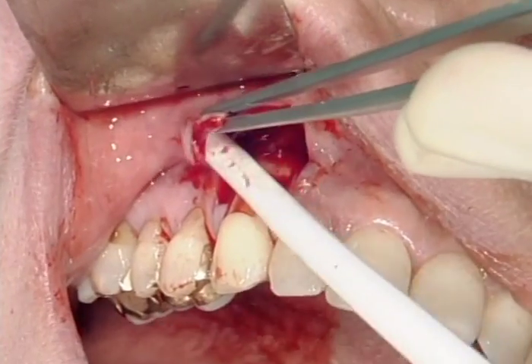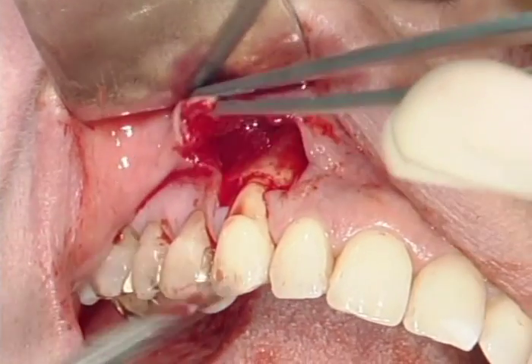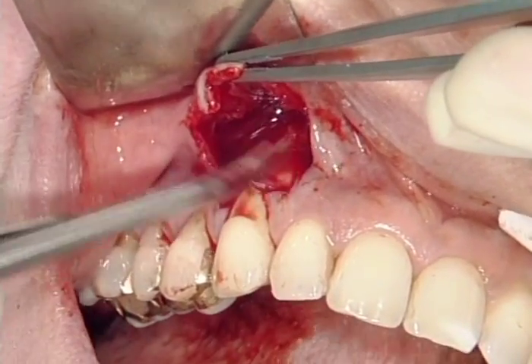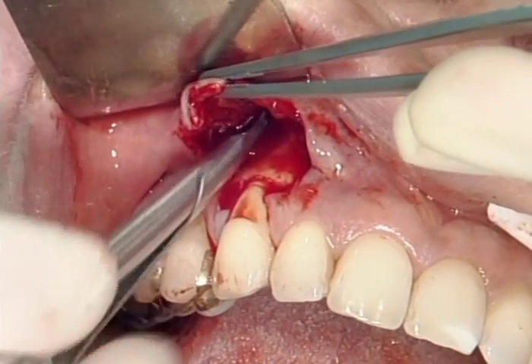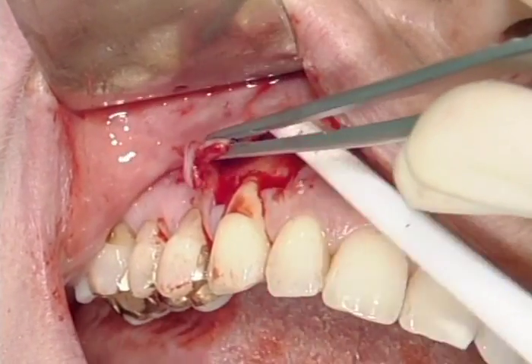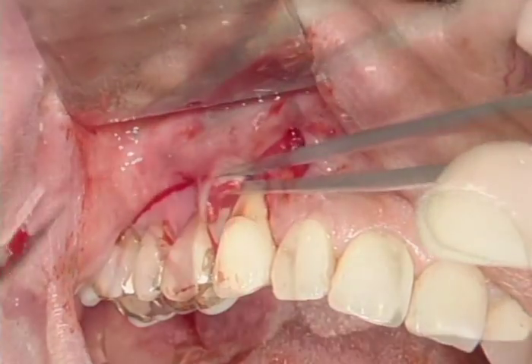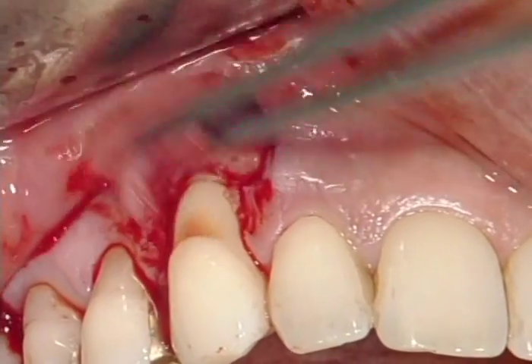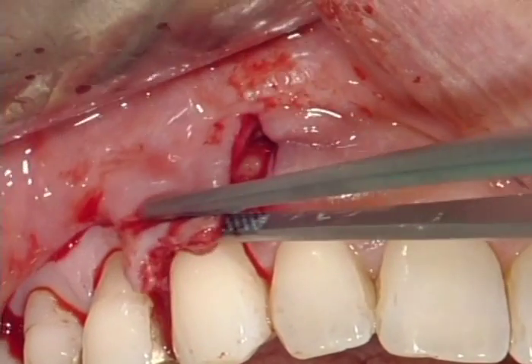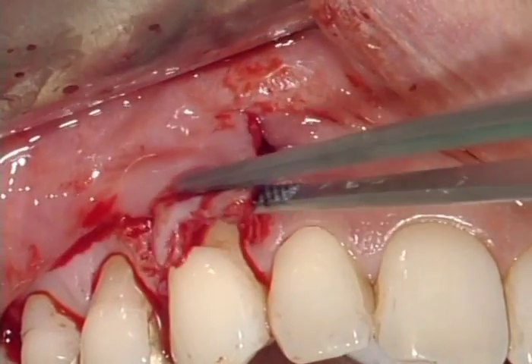The raising of a split thickness flap is continued by blunt dissection. The blunt dissection is extended apically and laterally. The aim is to eliminate any muscle tension on the flap margins and allow for a passive and tension-free coronal positioning of the flap at the CEJ level.